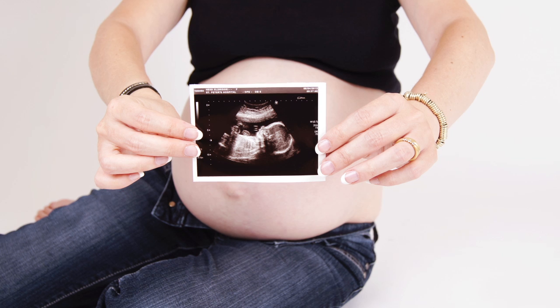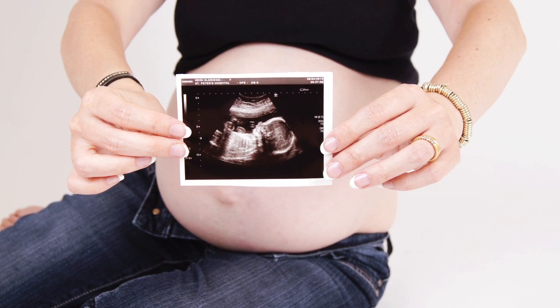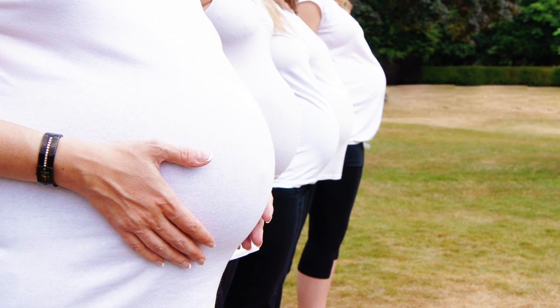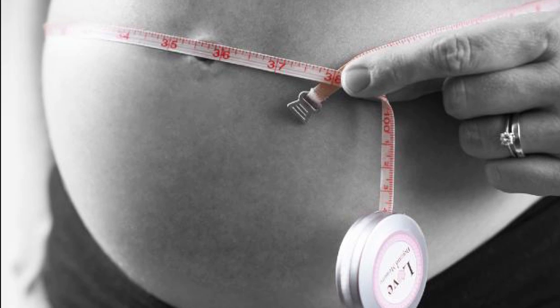Growth restriction in an unborn child is the single largest risk factor for stillbirth, especially when it goes unrecognised. Symphysis fundal height is a widely used method of monitoring fetal growth and is usually measured from 28 weeks gestation in babies in a longitudinal lie. However, evidence shows that in low risk pregnancies, as few as 30% of small for gestational age babies are being recorded.